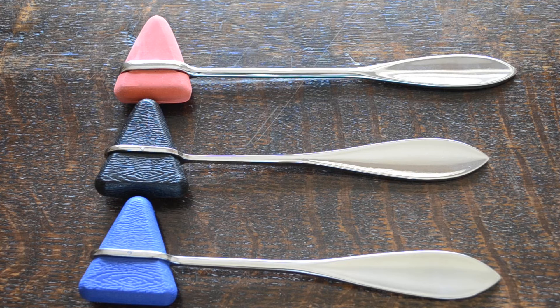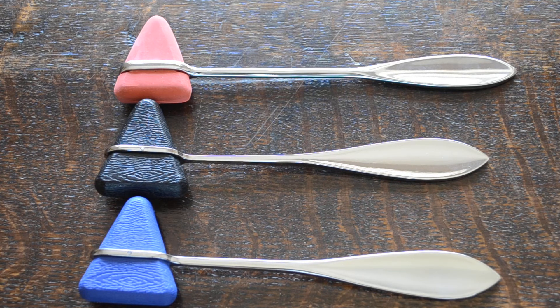It's basically a matter of personal choice in terms of what option you go for. They'll all do the same thing.